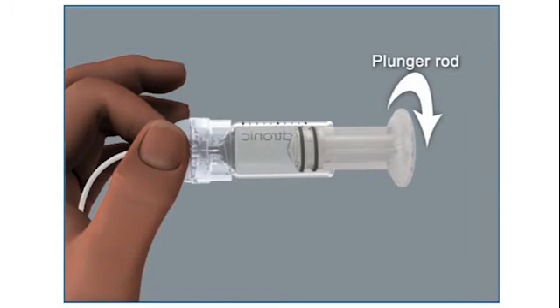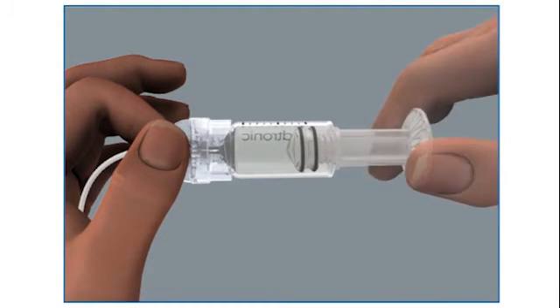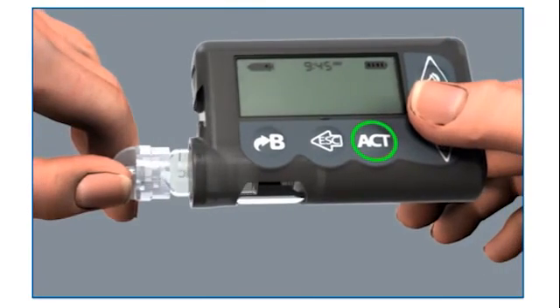Unscrew the plunger rod counter-clockwise until it completely separates from the reservoir. Be careful not to pull down on the plunger as you unscrew the plunger rod, and avoid squeezing the O-rings as you do so. Then insert the reservoir into your pump.